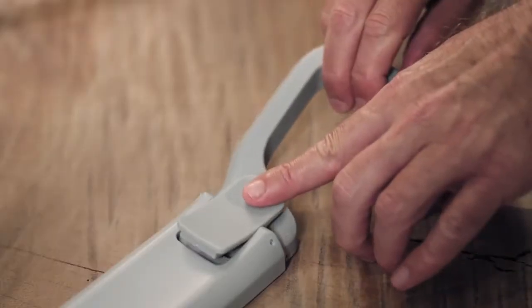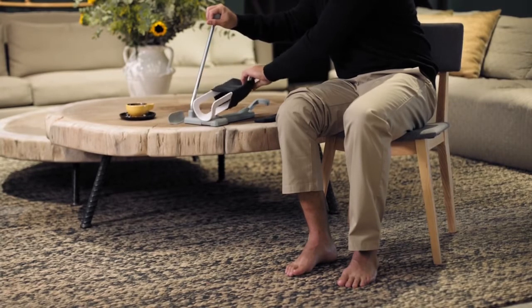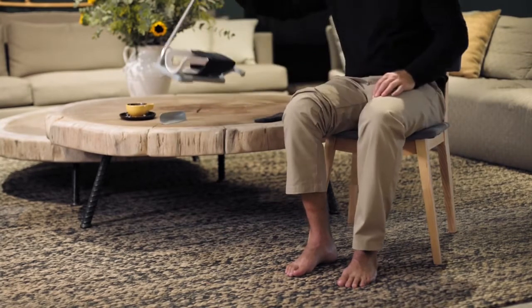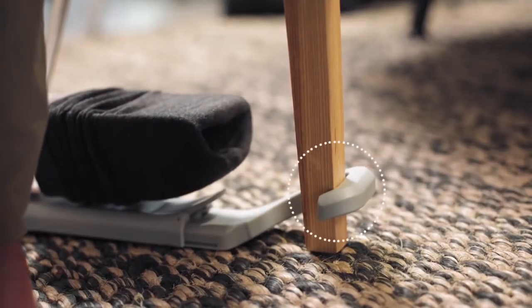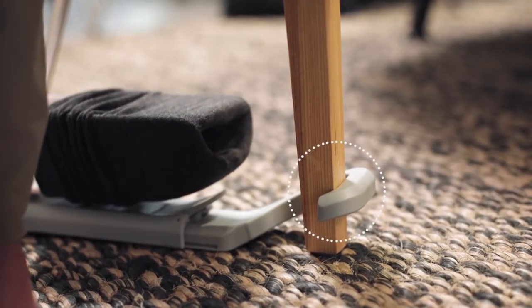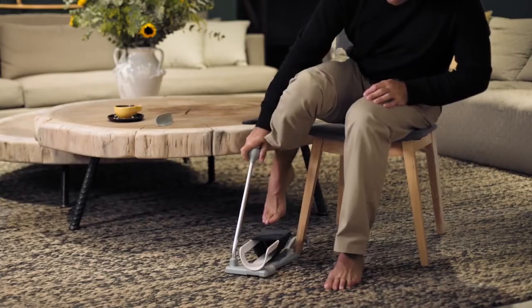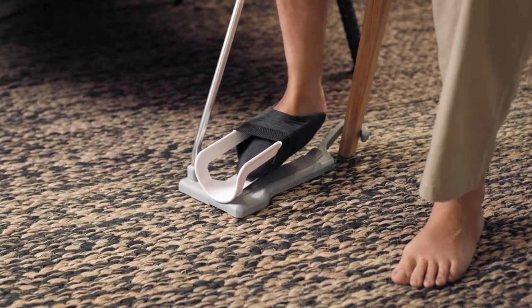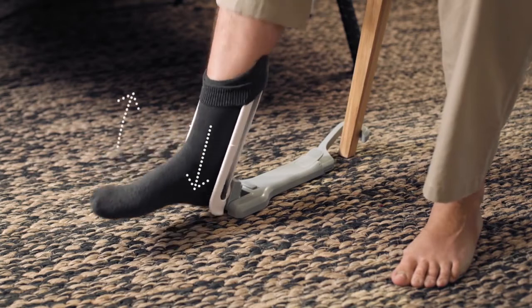Adjust the hook to a convenient length and lower the Socky arm to a horizontal position. Using the handle, lower the Socky to the floor and anchor the hook around the chair leg to prevent it from moving. Move the Socky arm with your foot to face the outer side of the chair. Pull your leg back around the chair and slide your foot into the sock. Push down while bending your heel towards you.